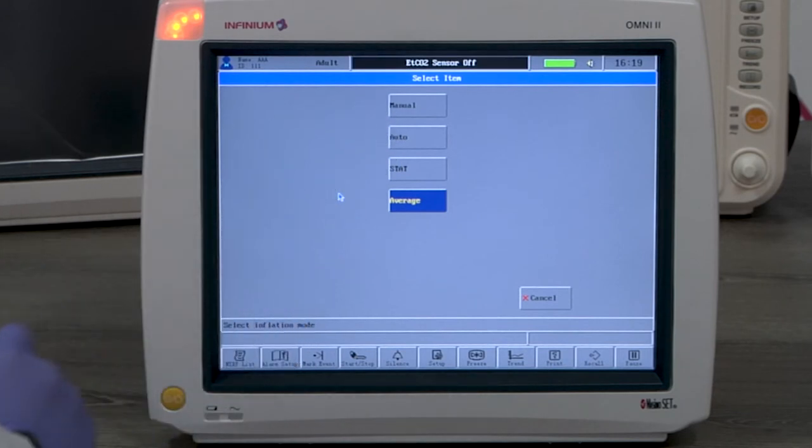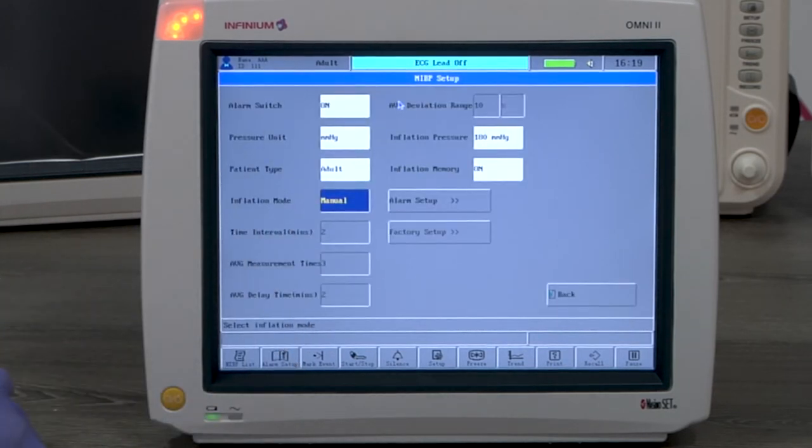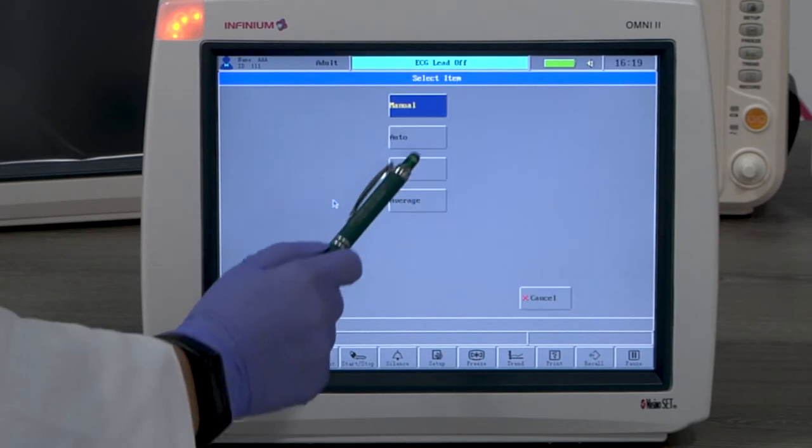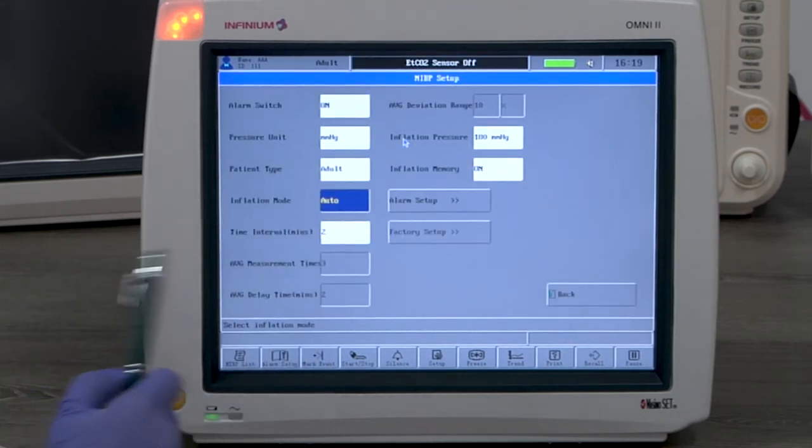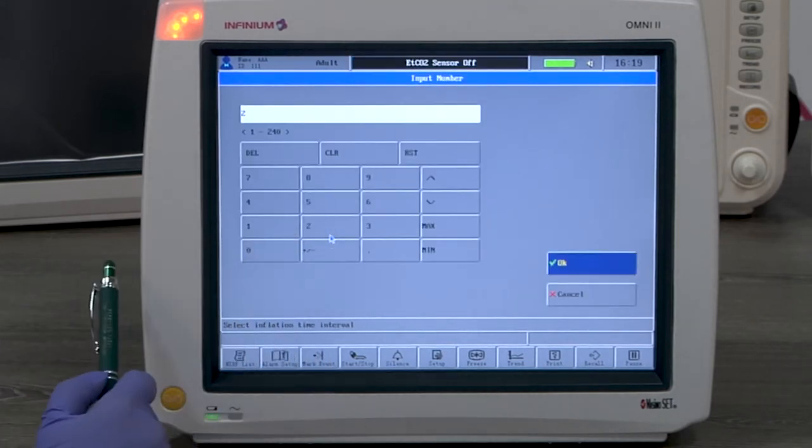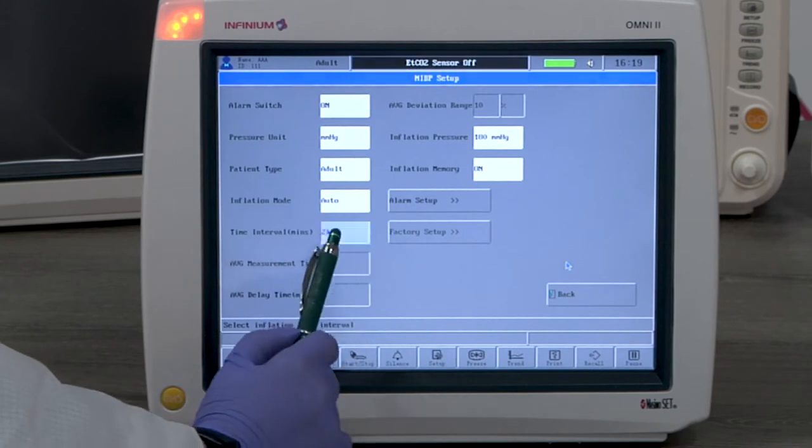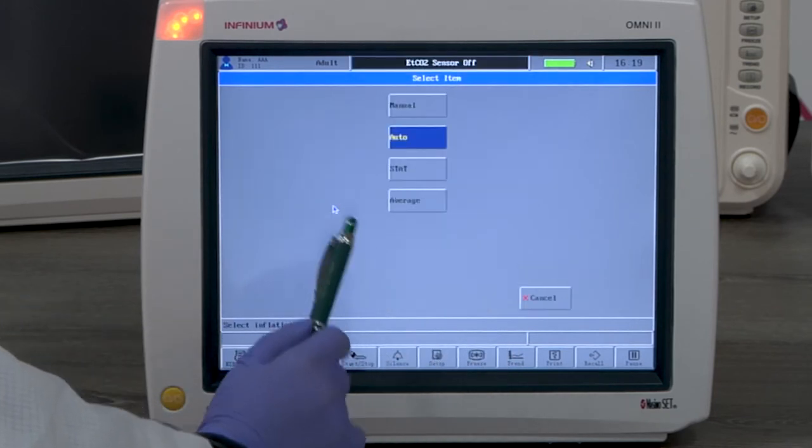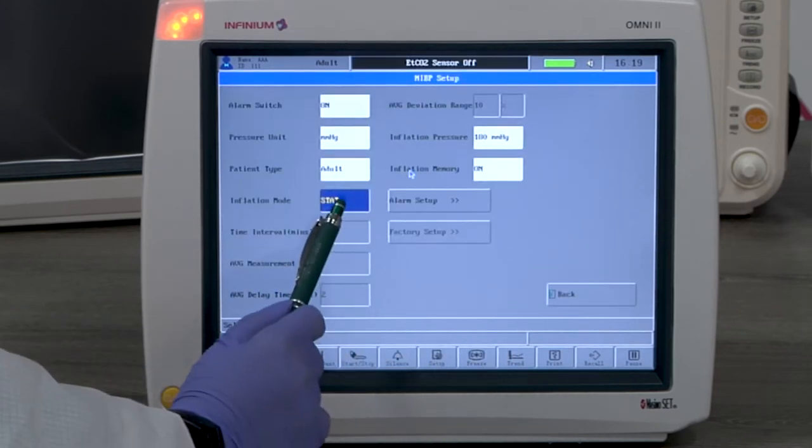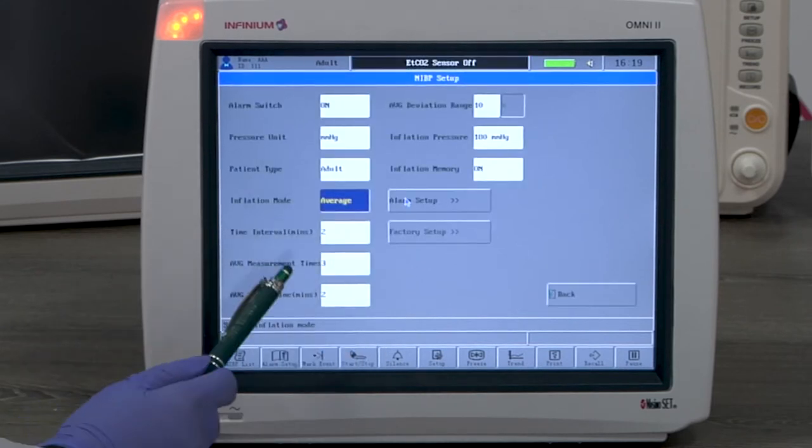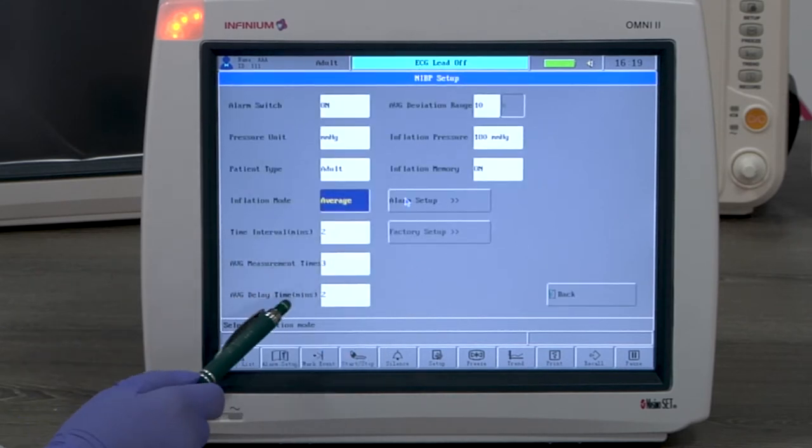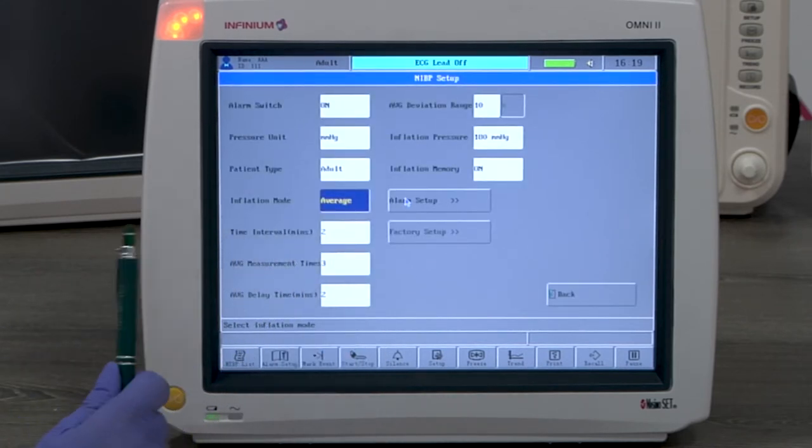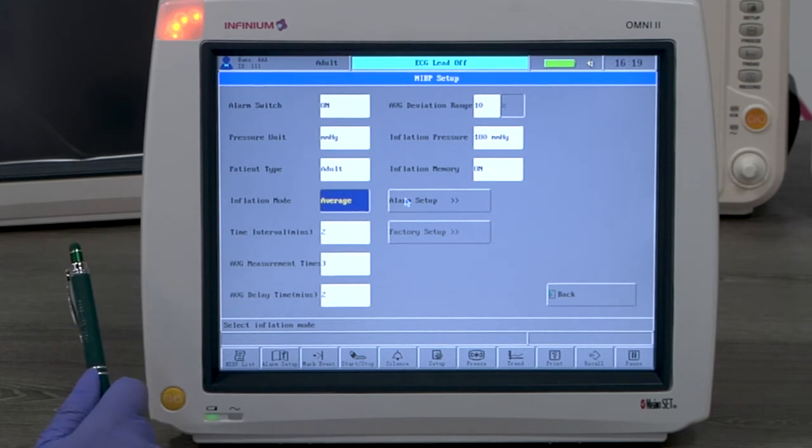We have four inflation modes to select. Manual mode only measures when you give a command. Auto mode measures automatically according to the set interval. Stat mode takes three measurements when you give a command. Average mode takes multiple measurements with the delay time set between each measurement and displays the average results from these measurements.